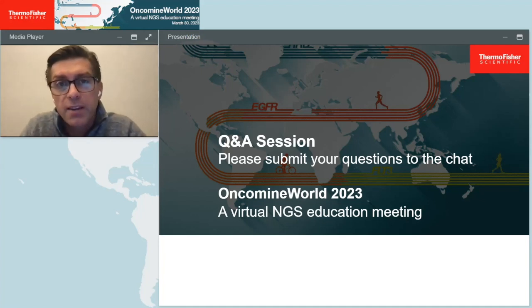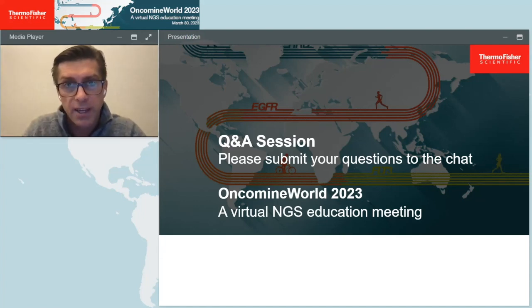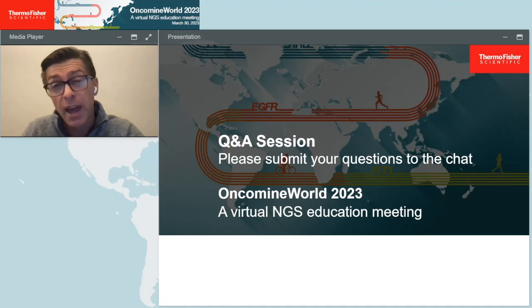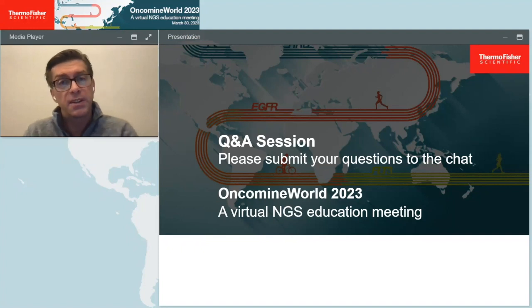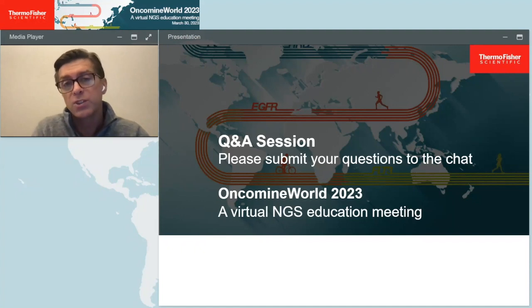See a question, how do we calculate the DNA concentration after extraction without purification systems? So it is important to actually calculate the DNA concentration before you load it onto the Genexus sequencer if you are not using the Genexus purification system. That's because the concentration of your input going into the library prep reaction is important. You don't actually have to do the dilution, you just have to know what the concentration is.